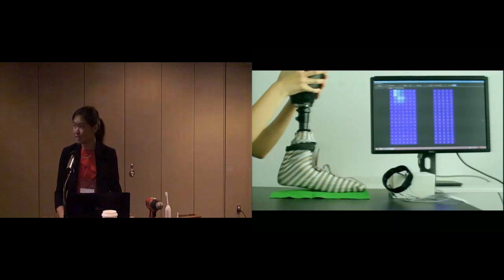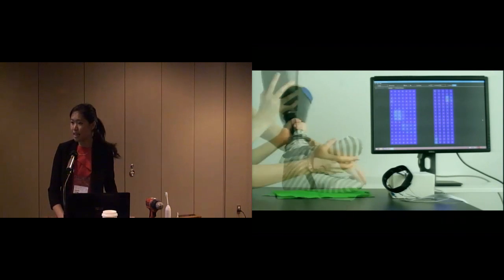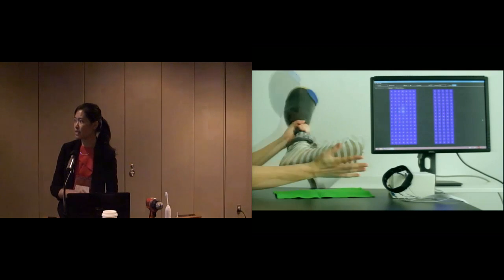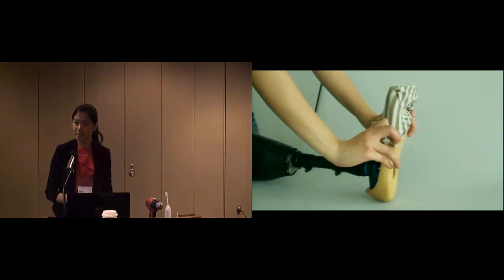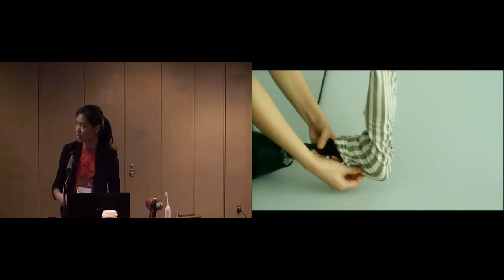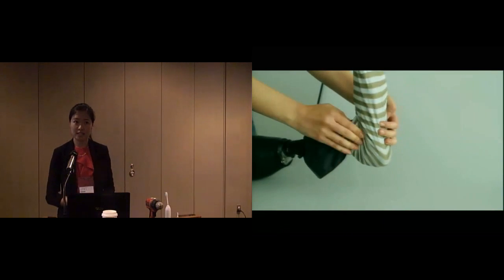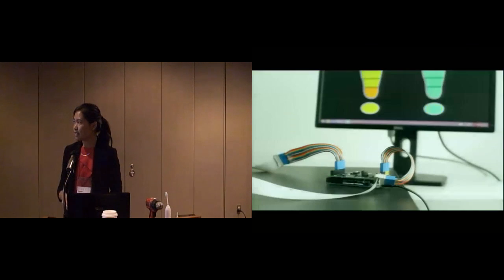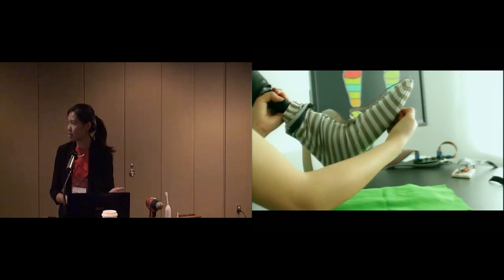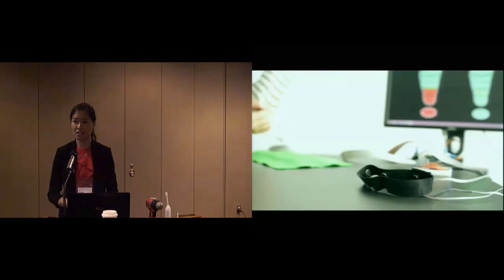So the result was this. Here's a prosthetic leg. It's wearing the proCover sock. And you can see that it's detecting different types of touches I'm applying to the foot. It consists of three layers. So two layers of conductive zebra fabric, which you can see here, sandwiching a layer of piezo-resistive fabric. And this comes together to create a sock that also offers all-over sensing. The sock forwards information to the hardware board, and it can detect both location and pressure of the different touches.